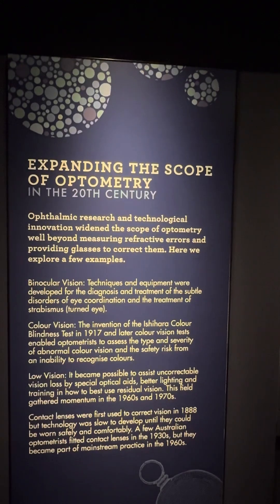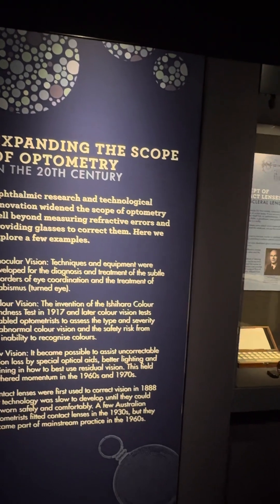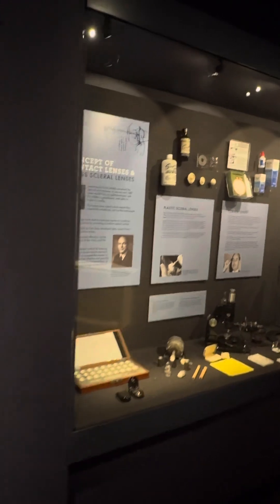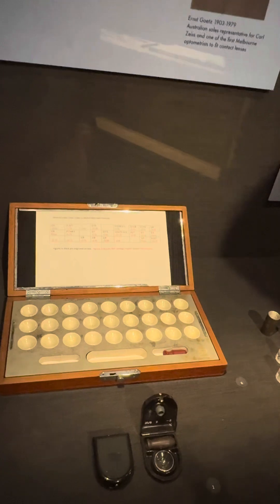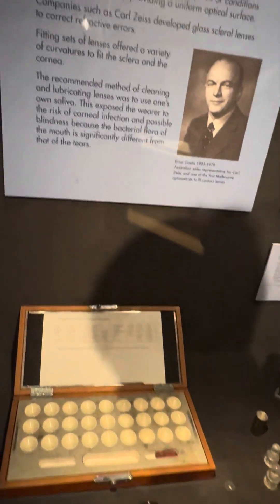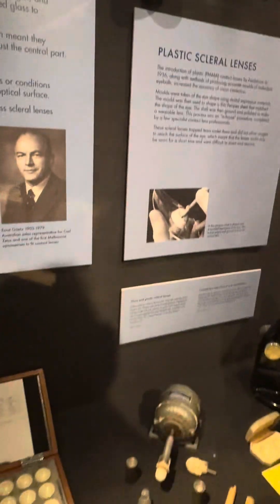The next stage we move to is the 20th century, getting up to probably close to the year 2000. This section covers contact lenses, where the lens is put directly onto the eye. The fellow who was involved in low vision also developed contact lenses in Germany, and that is what we believe he brought out with him.